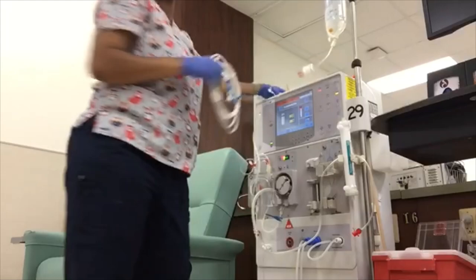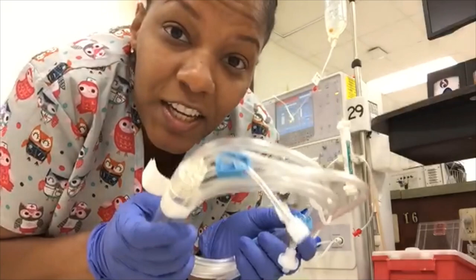So far I just hooked up the arterial line to the saline bag so that it can run through and clear out some of the air bubbles. And this is our venous line, and I'm about to hook that up now.